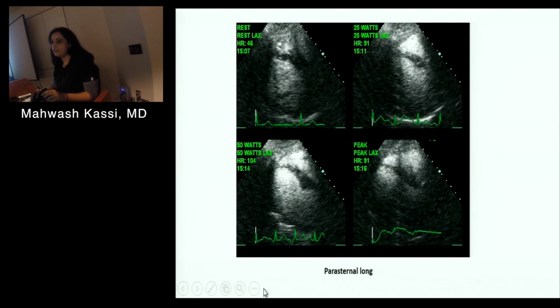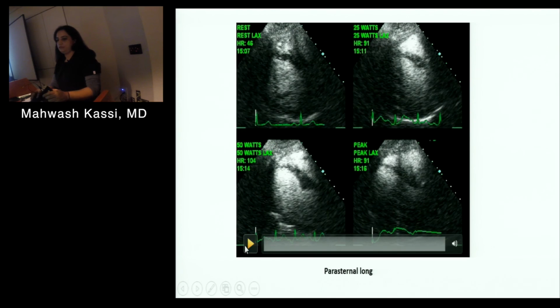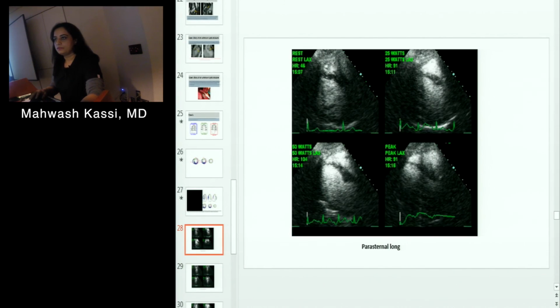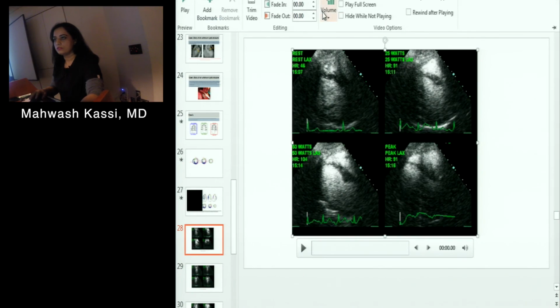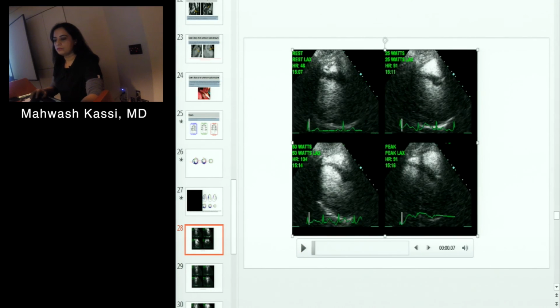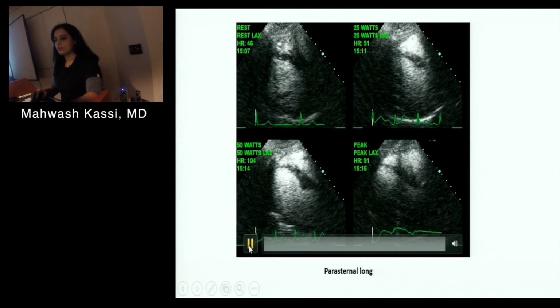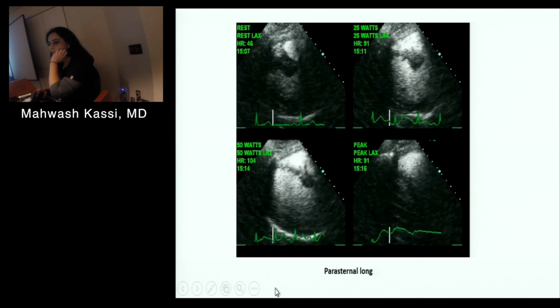So this is the bicycle stress echo of that lady. Let me just loop this. I have looped it, but I don't know. Okay. So I'm going to let you look at it for like 2 minutes and then move on to the next one.